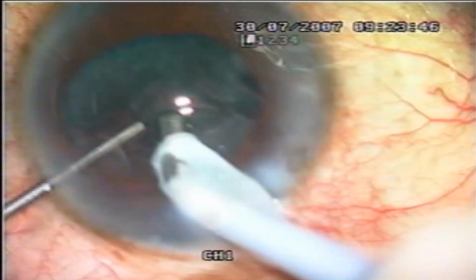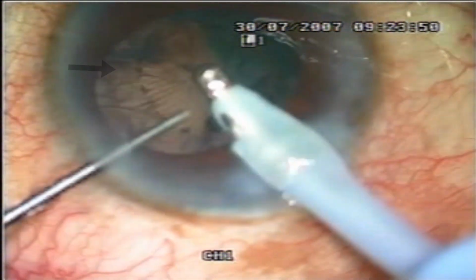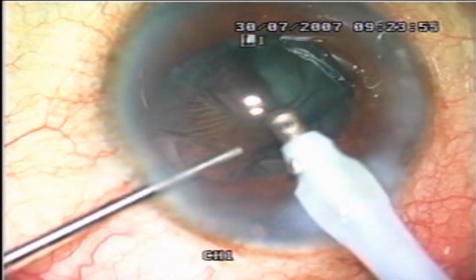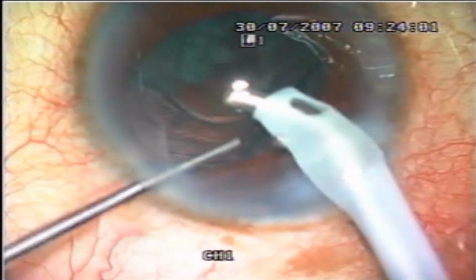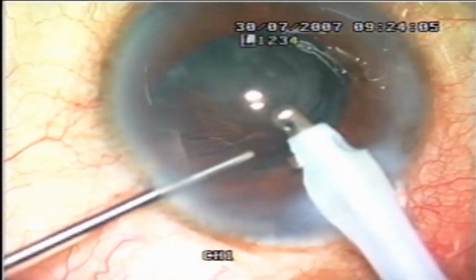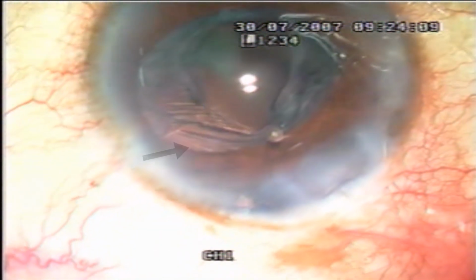This video shows how, in the presence of a posterior capsular rupture, we should not pull out of the eye. As you can see here, the sudden pulling out enlarges the PC tear and more vitreous starts coming into the anterior chamber. And you can see that a nucleus bit has also gone into the vitreous cavity.